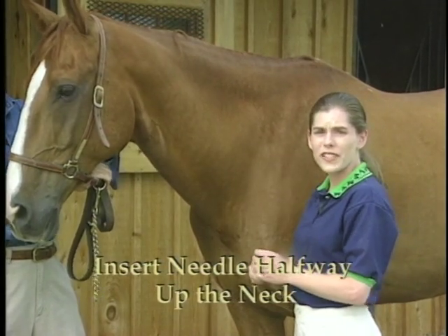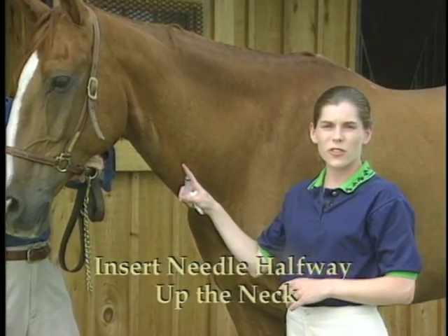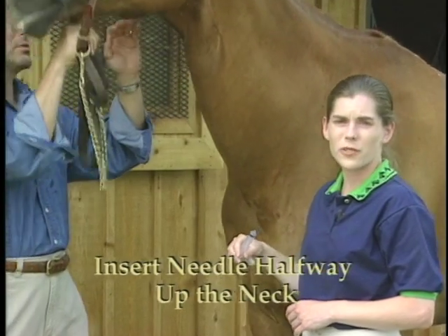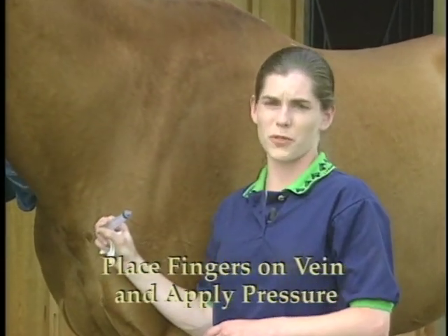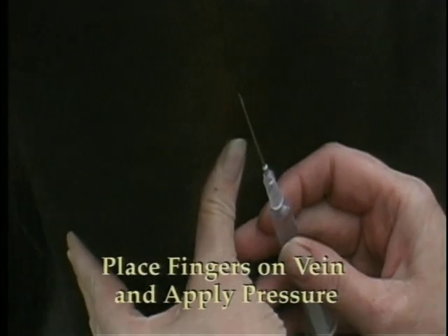Always insert the needle no higher than halfway up the neck. The closer you go to the head, the closer the artery is to the vein, and the greater the risk of injecting into the artery. Place the fingers of your left hand — or reverse this procedure if you're left-handed — into the groove to apply pressure on the vein, causing it to fill.